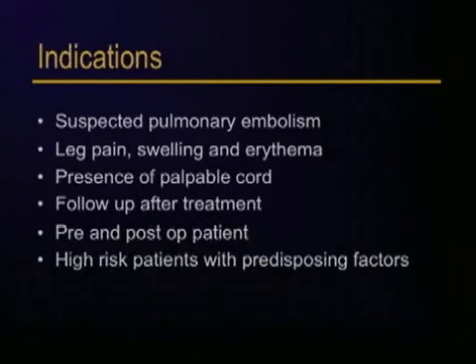What are the indications for lower extremity examination? Well, patients with suspected pulmonary embolism, those experiencing leg pain, swelling, or erythema, the presence of a palpable cord. Patients may have a lower extremity Doppler exam after treatment. Pre- and post-operative patients may also get the study, as well as high-risk patients with predisposing factors, as I indicated in the prior slide.